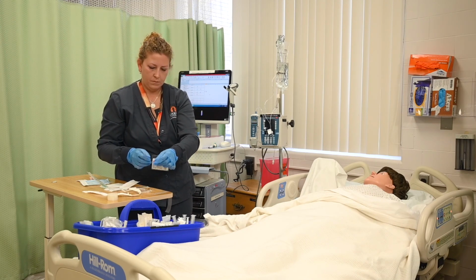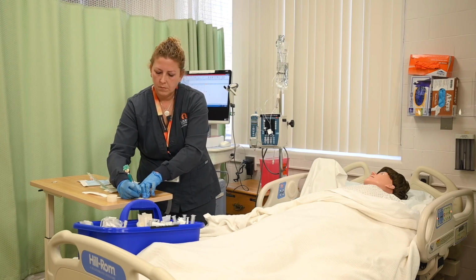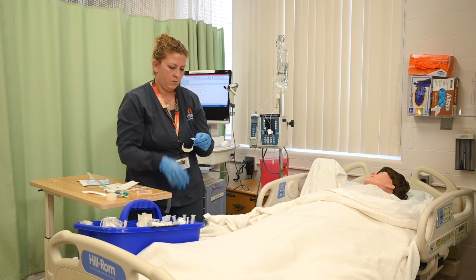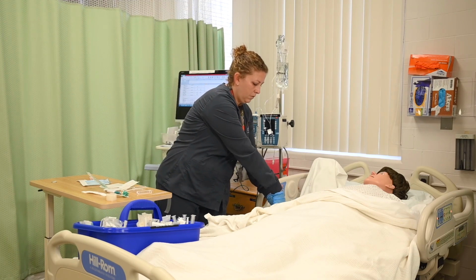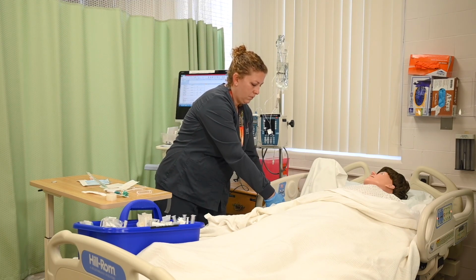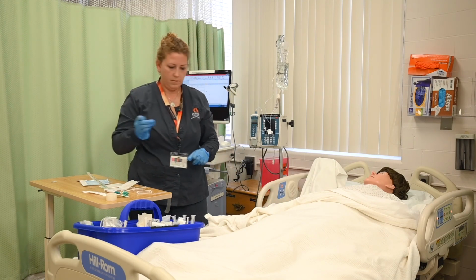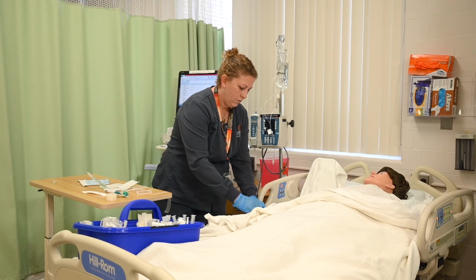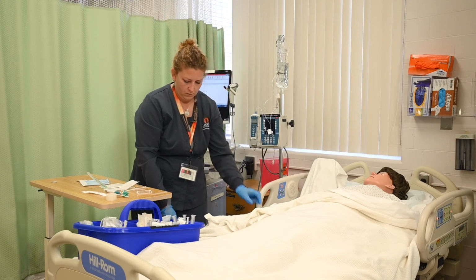Sarah will label the IV dressing in accordance with agency policy, including the date, time, gauge, and length of needle, and her initials. At this time, she would apply a swab cap if not administering IV solution, but we're going to show you using the IV solution. Dispose of the needle in the sharps container.